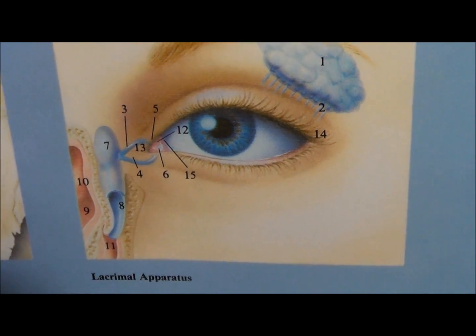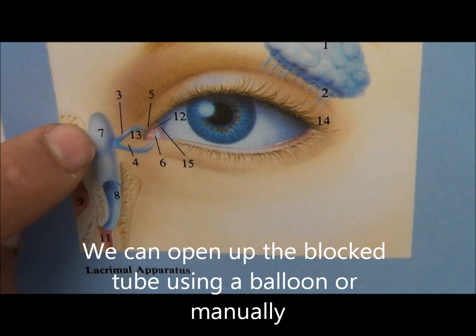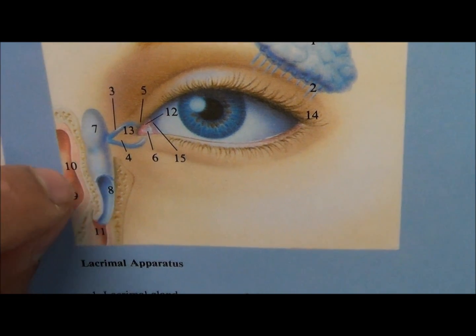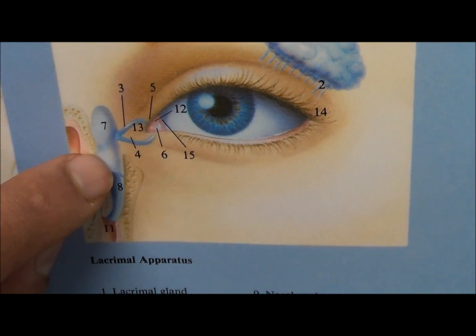What we do with this transnasal DCR is we actually go into the system and we're able to stretch this narrowing. We can do it either using a balloon to widen it, or manually through the nose we're able to widen the system.